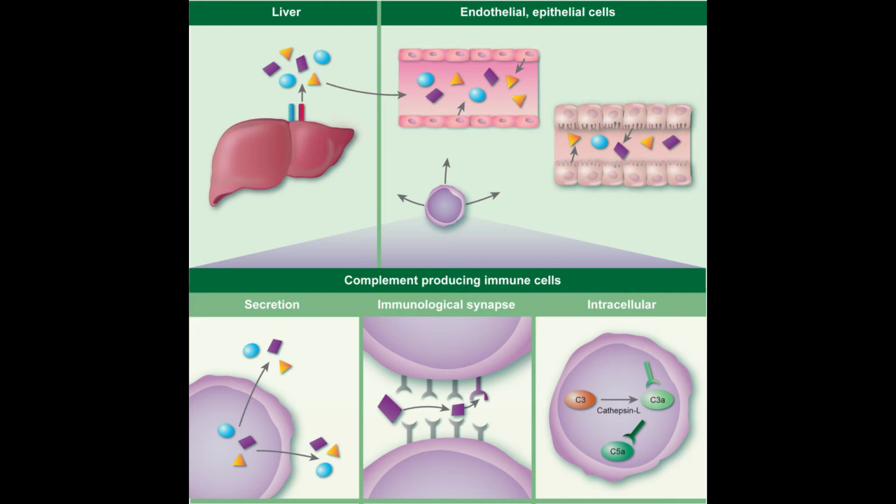Specimen handling is extremely important. Blood should be collected in a clot tube with no serum separator. The tube should be spun down and the serum should be frozen or placed on dry ice if it is not tested within 1 to 2 hours. If a specimen has been inadequately refrigerated, been subjected to multiple freeze thaws, or been in prolonged storage, the results may be invalid and the test needs to be repeated with a fresh specimen. Control serum should also be included with each batch of test sera.